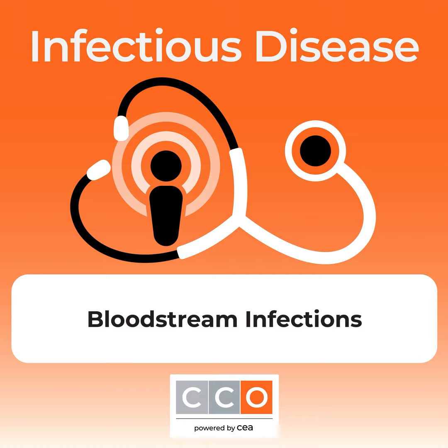So, in conclusion, back to our roadmap, we want to make sure that we're culturing the right patients, using those rapid technologies to get information quickly about what the patient's growing, and then in conjunction with our local treatment algorithms and our antimicrobial stewardship team, communicating out to our primary teams to get patients on optimal antibiotics as soon as possible.